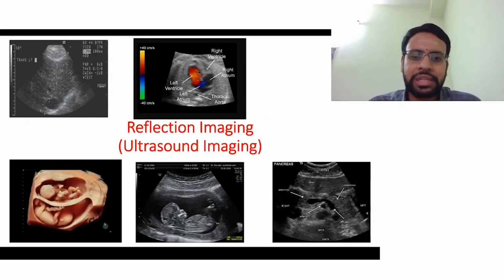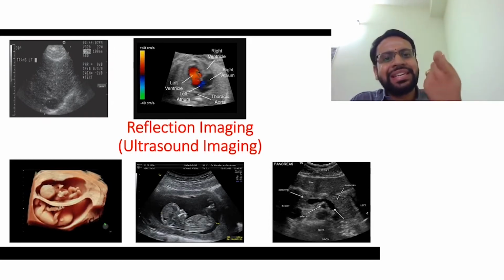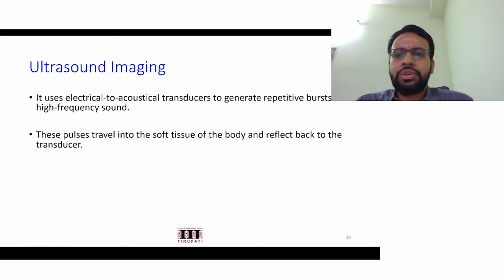So with that, let's take a look at another kind of imaging, reflection imaging. So this is where you are sensing the reflected signal from the object. Under this, we are discussing ultrasound imaging. This again, most of you, I'm sure, will be familiar with.